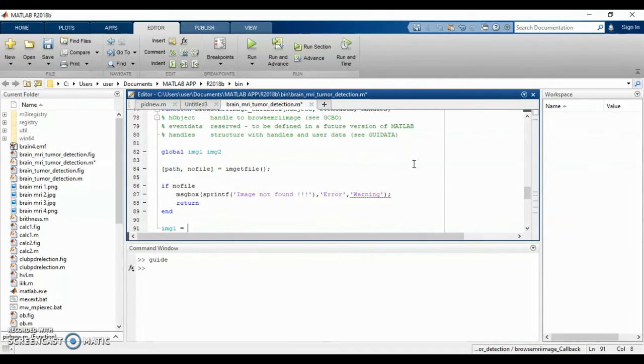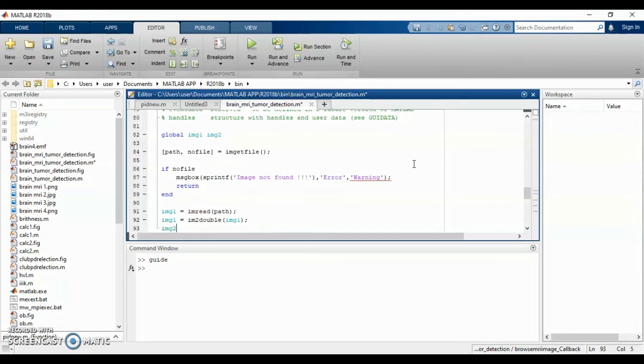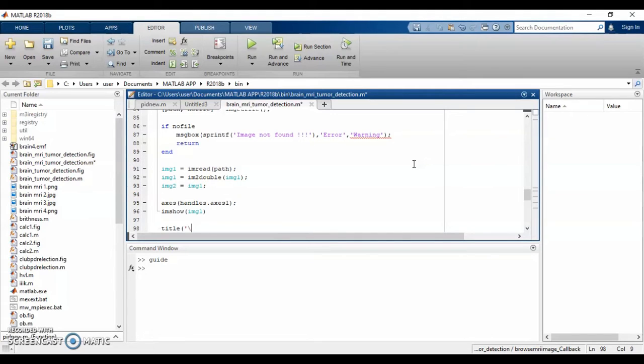And next, we will read the image by using the command imread, and convert the binary image to double precision intensity image by using the command im2double. So since we want to show the image in axis 1, we will type the command axes and handles.axes1, and then our image will pop up in the axis 1. So for the title, we will name the title as Brain MRI with the font size of 20 and purple color.